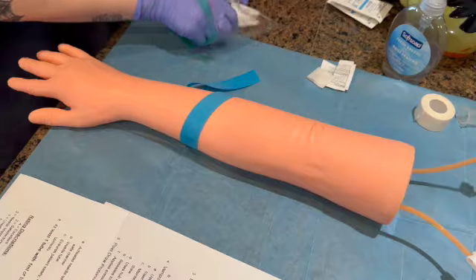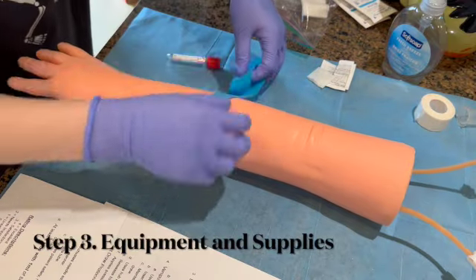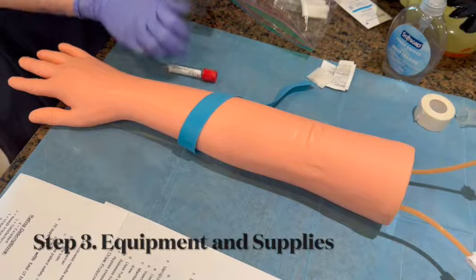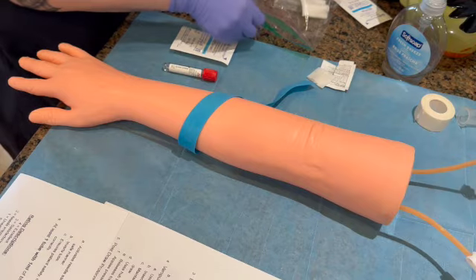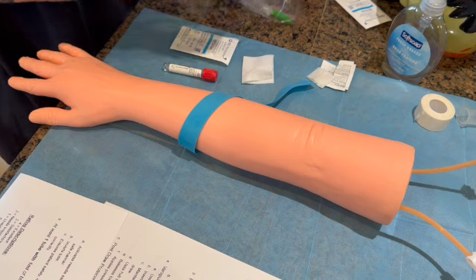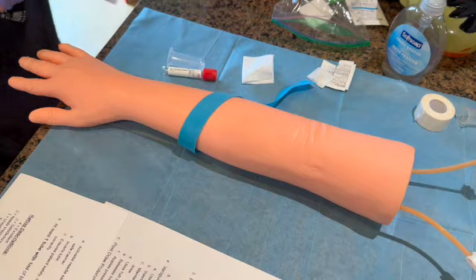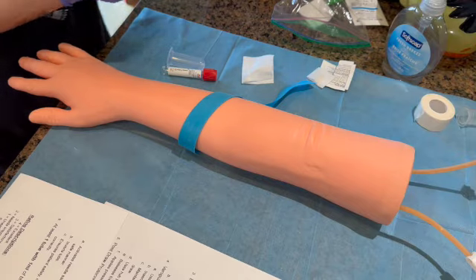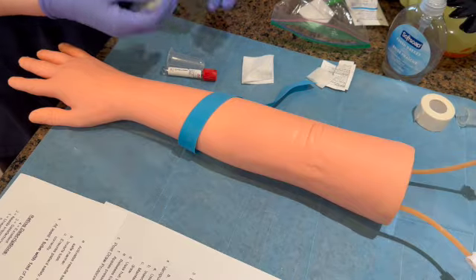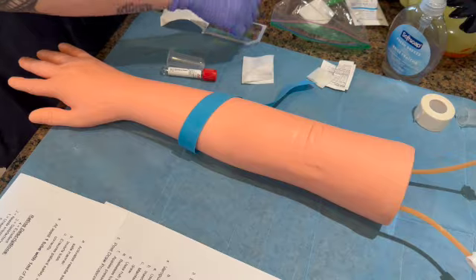And we're gonna prep the rest of our equipment. So we're gonna grab our single tube for our butterfly venipuncture. Also gonna prepare our butterfly. We've got our gauze ready to go here, as well as our hub. And while that dries, I'm going to move into step 3, which was selecting and assembling all appropriate equipment using correct needle type, tube, gauze, etc.